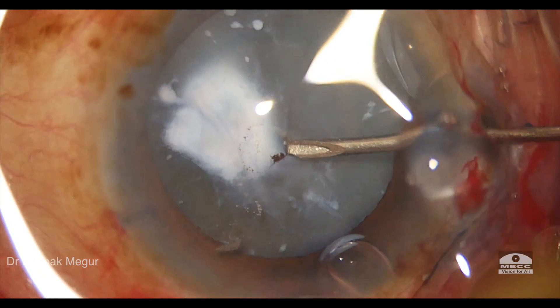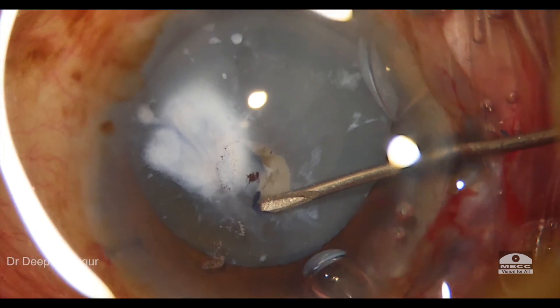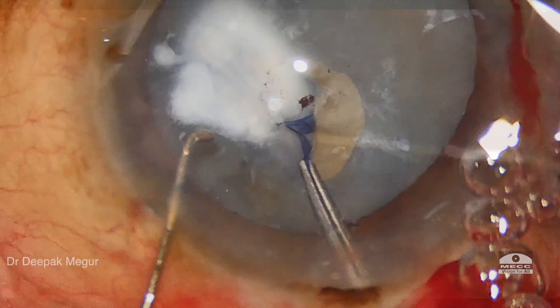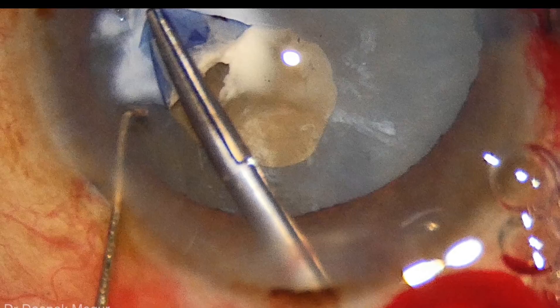This is an 80-year-old lady with a calcified capsule in a hypermature cataract. I'm trying to puncture the capsule and lift a flap, and once I lift the flap you can see there's a thick underlying subcapsular plaque — a calcified plaque.